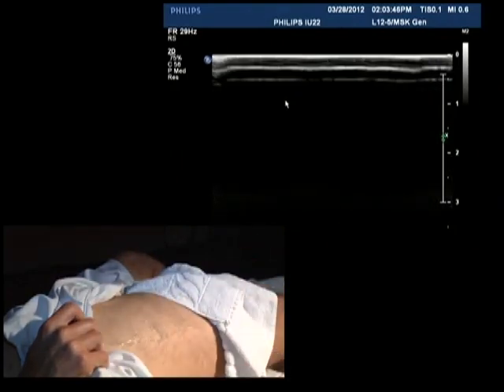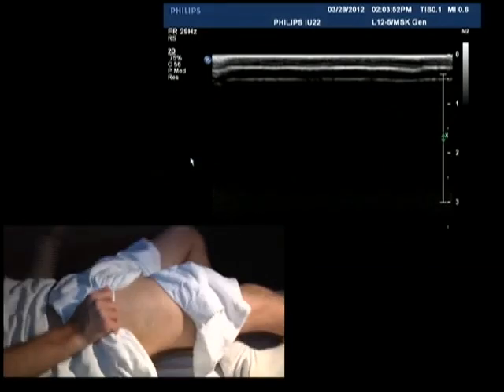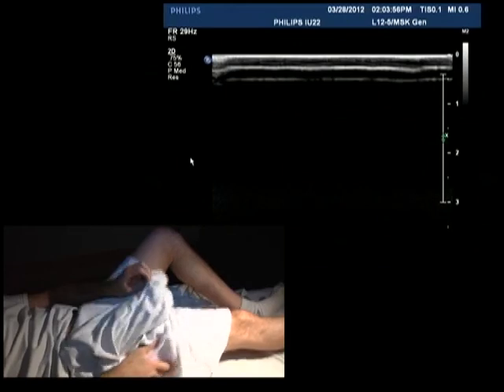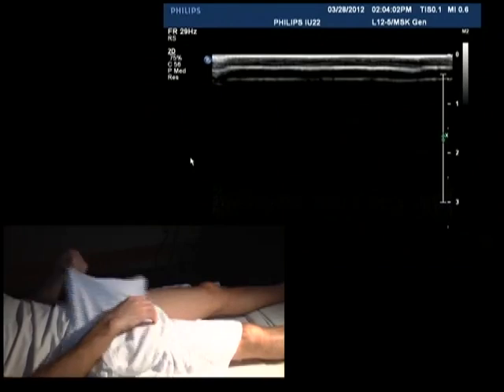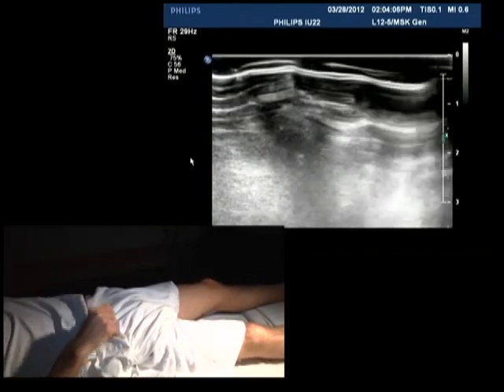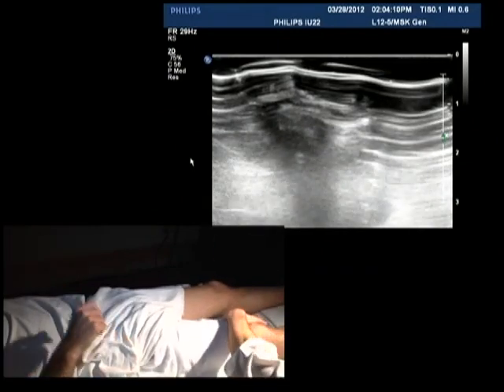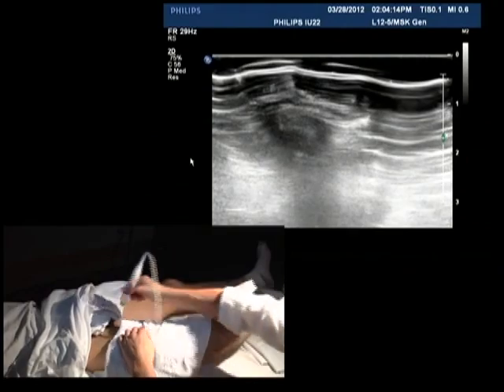All right, let's do the medial hip next. I'll have you go ahead and straighten out just on your back. Straighten out both legs, and then we're going to have you bring your leg kind of up and out a little bit. You can straighten your other leg there. So flex your knee a little bit and bring your leg out like that. Okay.